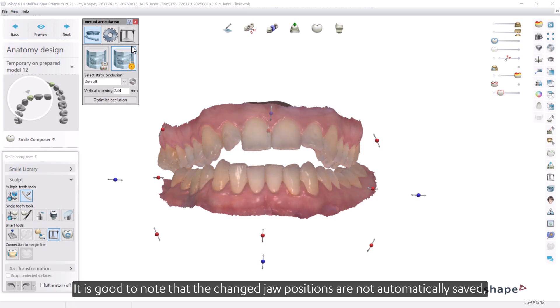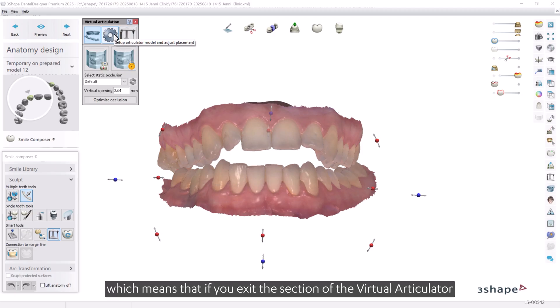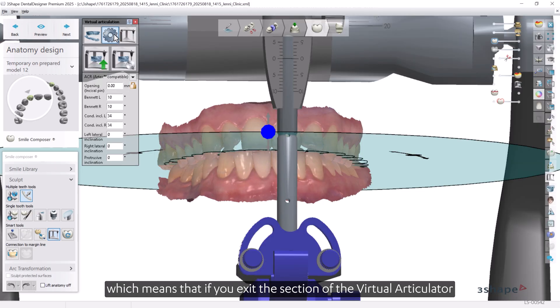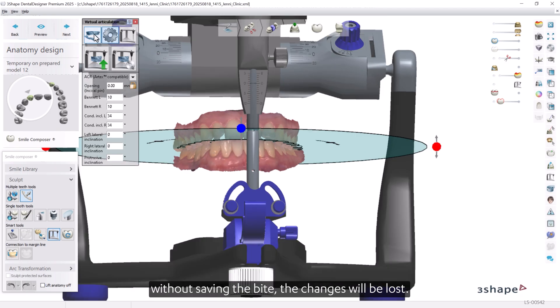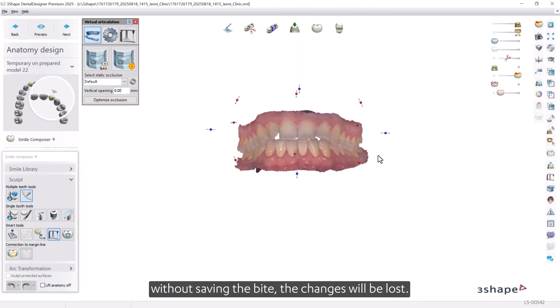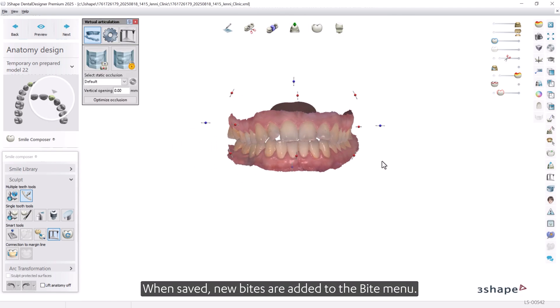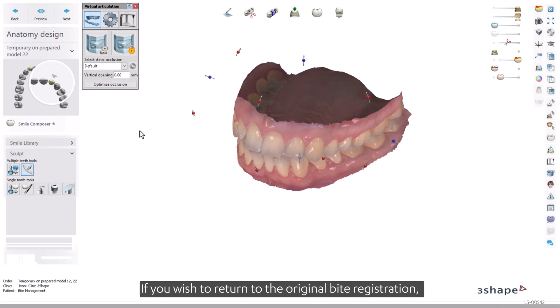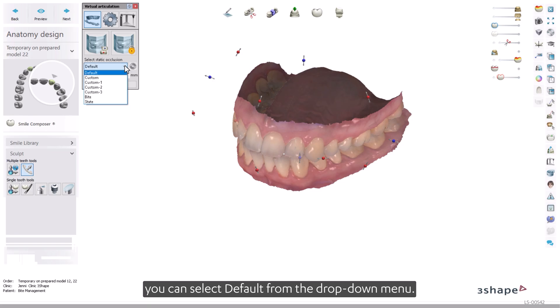It is good to note that changed jaw positions are not automatically saved, which means that if you exit the section of the Virtual Articulator without saving the bites, the changes will be lost. When saved, new bites are added to the bite menu. If you wish to return to the original bite registration, you can select Default from the drop-down menu.